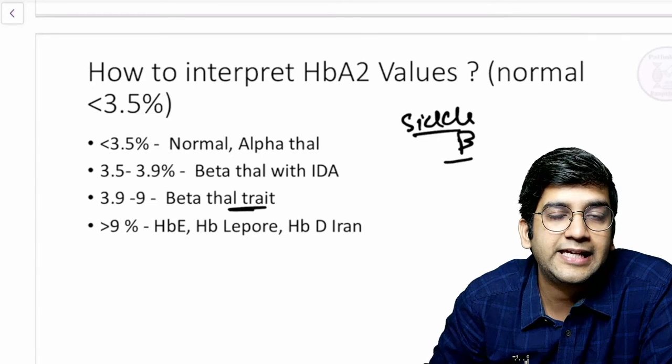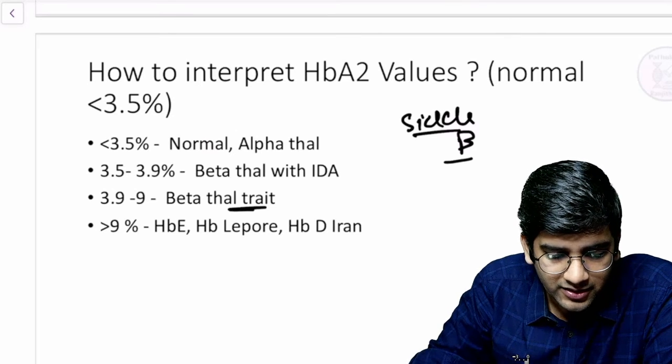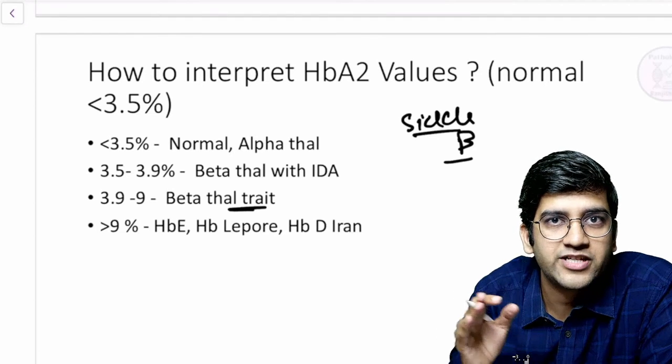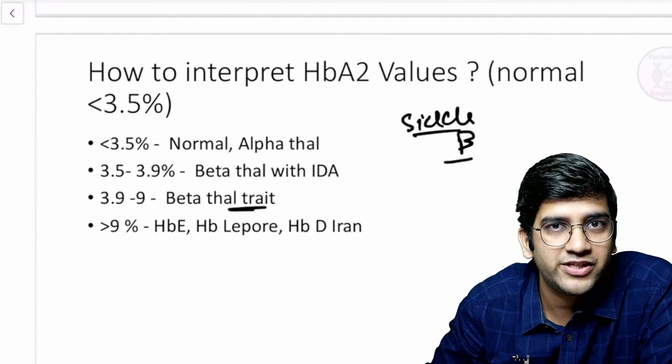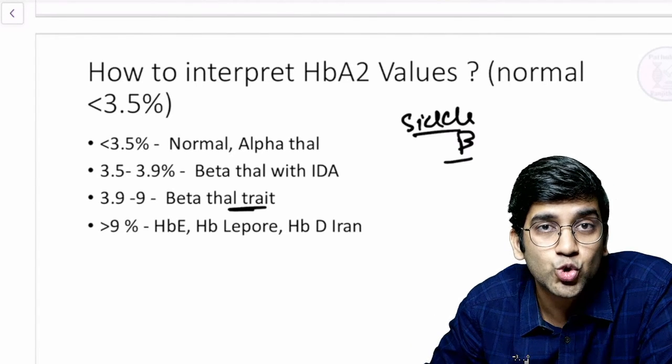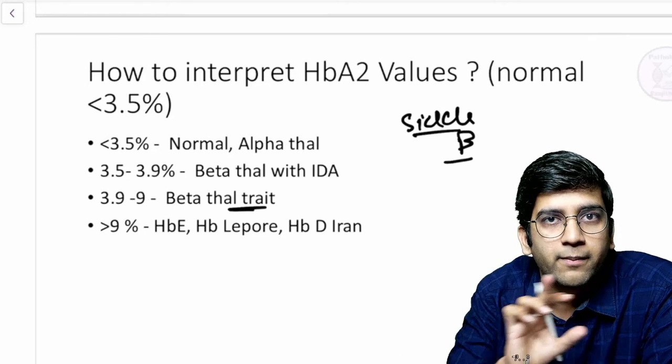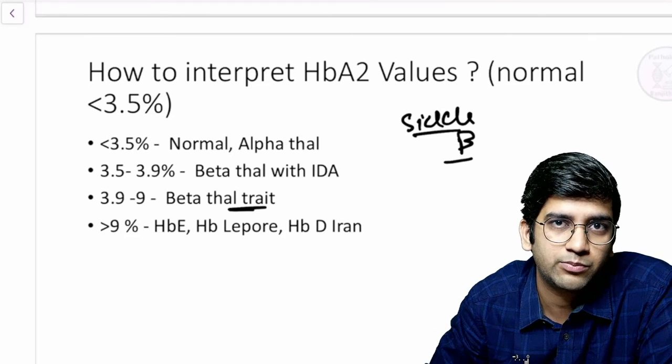You have to interpret each and everything. Like I said, I need the window. I need to interpret HbA2 separately. I need to interpret HbS separately. And obviously other windows. It's HbS with beta thalassemia. This also can be picked up on HPLC with simple information needed for you. Clinically, it's not matching. So it's something abnormal, right?